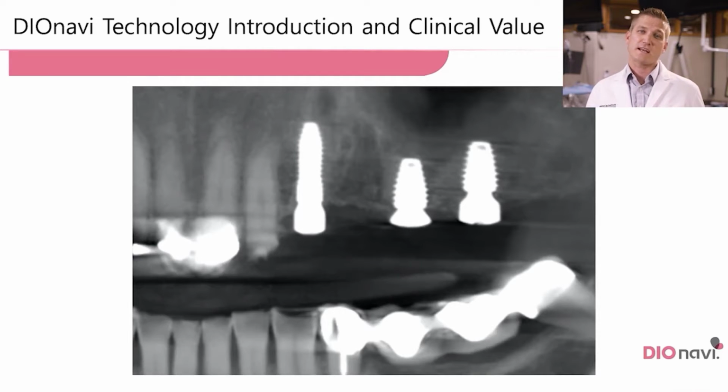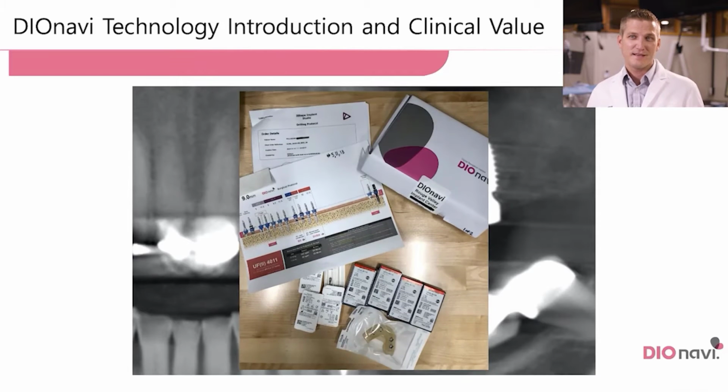So when we talk about this technology and how it really benefits us as providers, I think that X-ray tells the whole story right there. Maybe one last little thought.